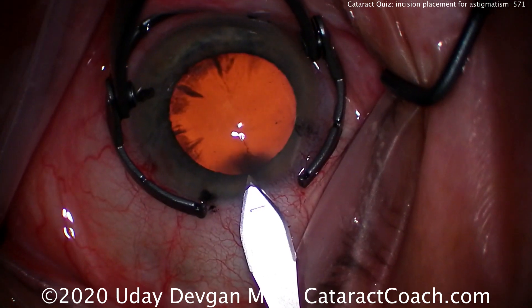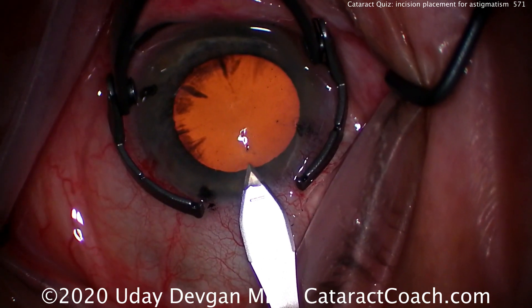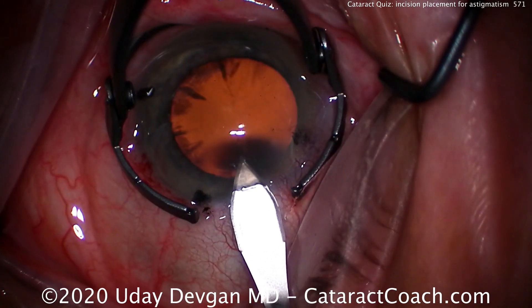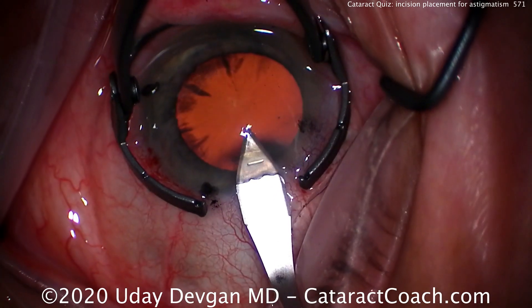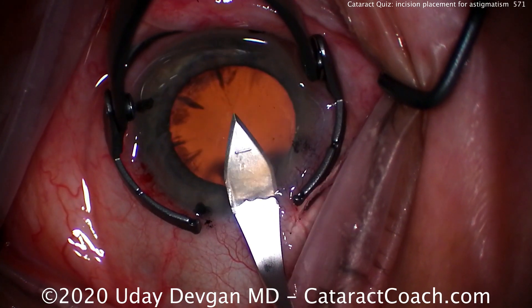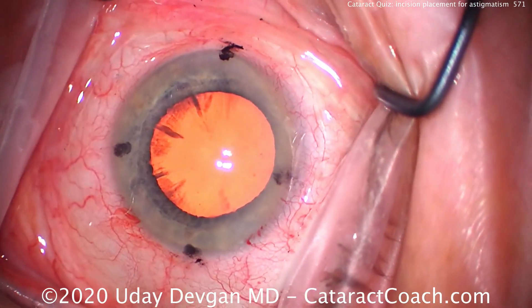This incision is going to be 2.8 millimeters wide, and it's going to cause, in general, about 0.25, maybe 0.3 diopters of flattening at that meridian.